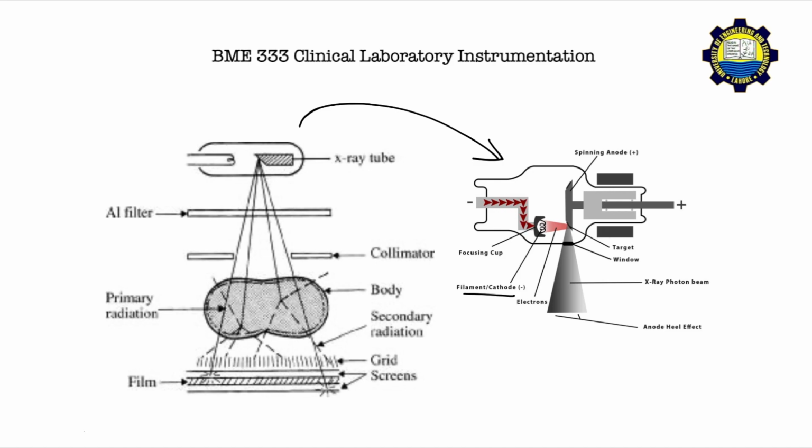So let's look at the components one by one to understand what is the role or function of each component in here. First off, the cathode filament is negatively charged.